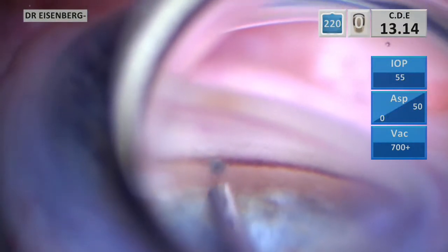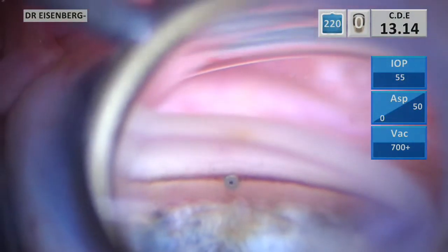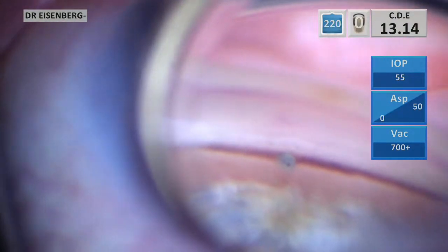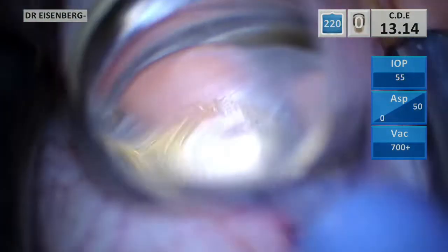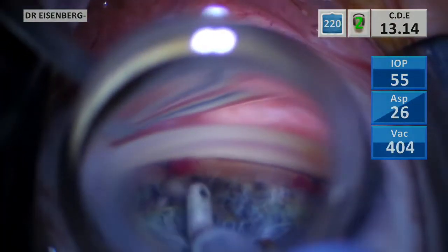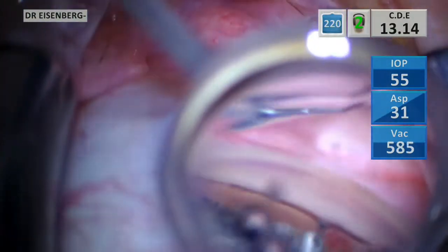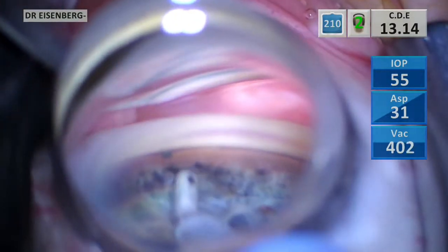And there it is — get it in. Give it a little tap just to make sure it's seated properly. I'm going to go out and come back in with my IA. And what we'll see — there it is. Both of them are doing a really nice job with some reflux. I like to clear out the viscoelastic right over the device first. I really don't want to push viscoelastic into the device in the canal.